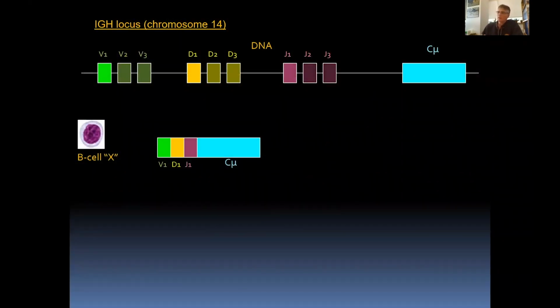Now, before we start dealing with somatic hypermutation analysis, I think that we need to explain briefly what is at stake here. What is the target area of DNA that is used for this analysis? The targeted area is the variable region of the heavy chain of the immunoglobulin. All B lymphocytes produce immunoglobulins. At first, I will present a simplified version, and then we'll view what the actual locus looks like. But for all intents and purposes, we will present a simplified version.